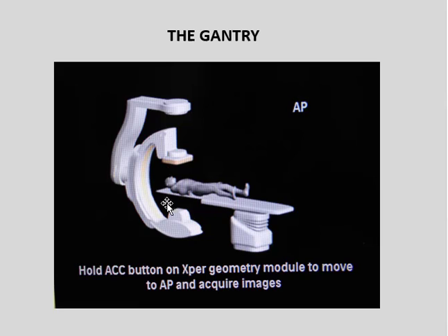Right now, it's in the AP position, anterior-posterior, although remember, the radiologists refer to the reverse. They refer to the image from the source. They call this posterior anterior. And cardiologists tend to abbreviate it, so we just call it the anterior view. Just be aware of the differences in terminology when you read different papers from different journals.